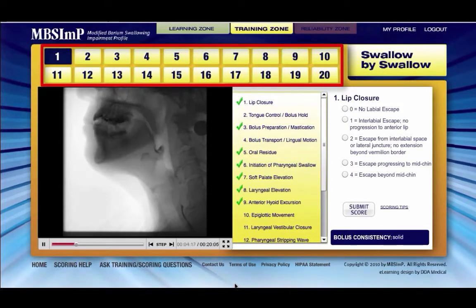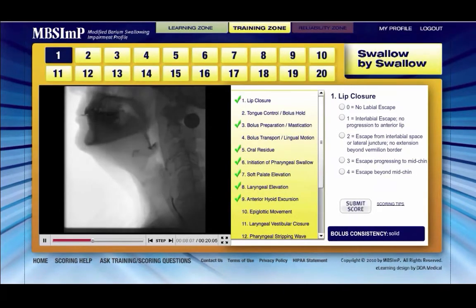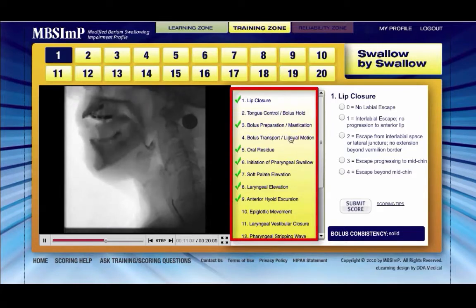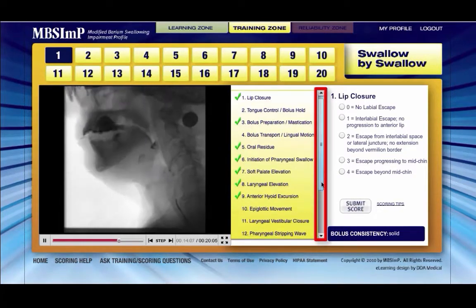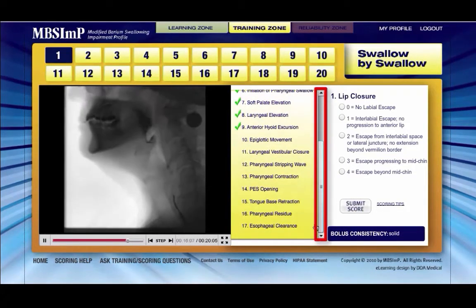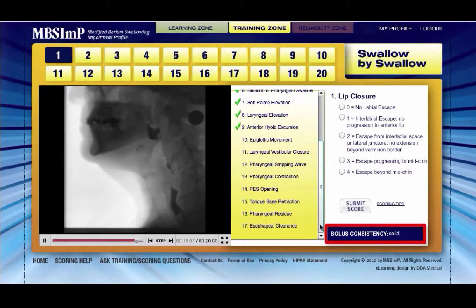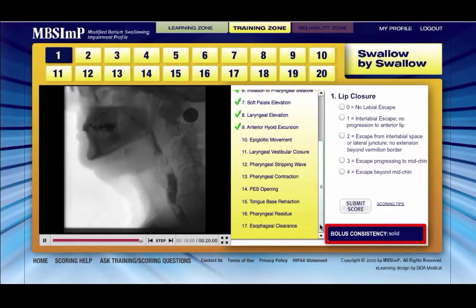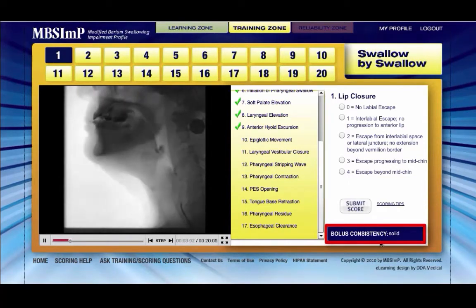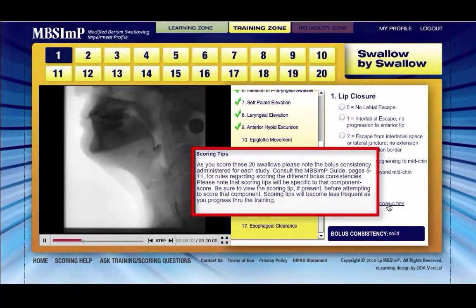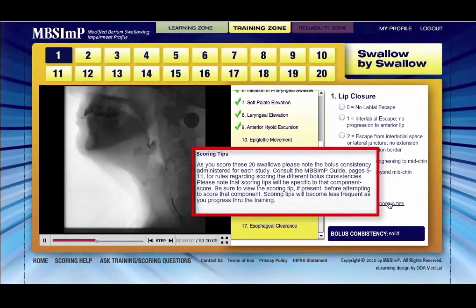Selecting any number above the media window will take you to that specific swallow. The 17 physiologic components are listed next to the media window; use the scroll bar to expose all 17. The area below the scoring panel displays the bolus consistency for each individual swallow. Make note of the consistency as this will determine how you score.